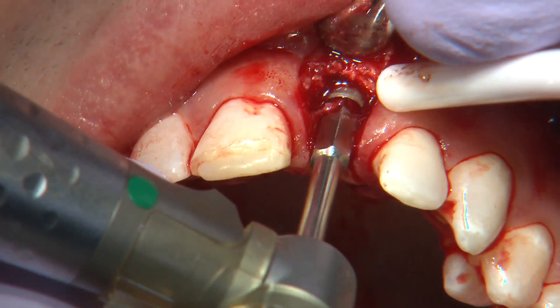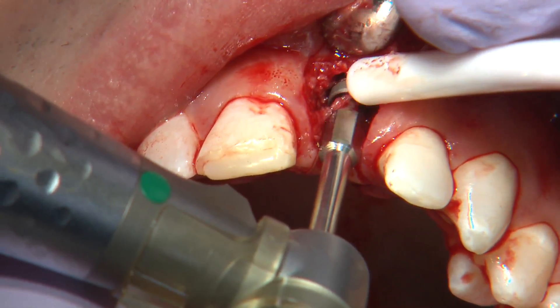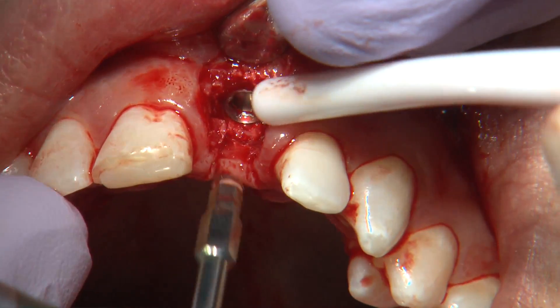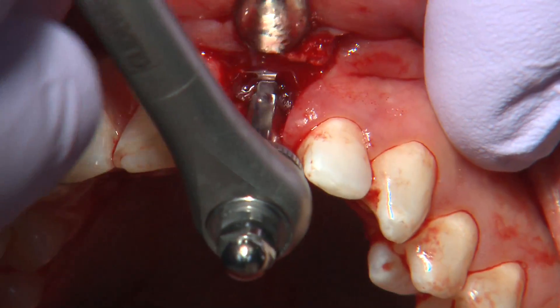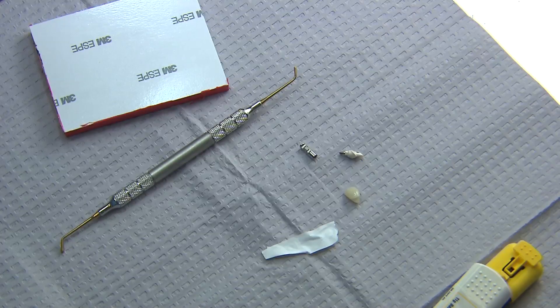The implant is placed at the bone level in this situation. We go ahead and place our temporary component. I also had the lab fabricate a temporary abutment and a temporary crown, so I can go ahead and try that in.